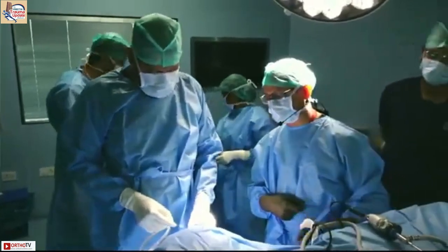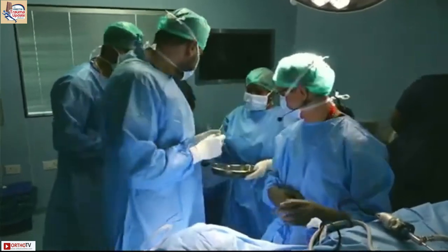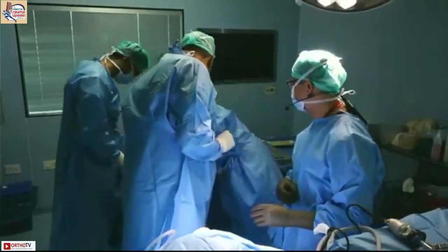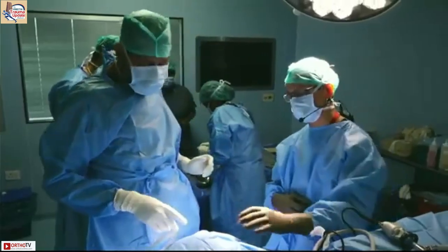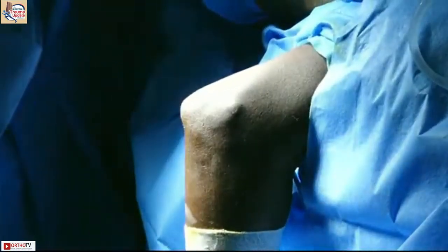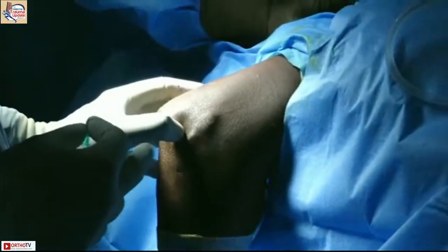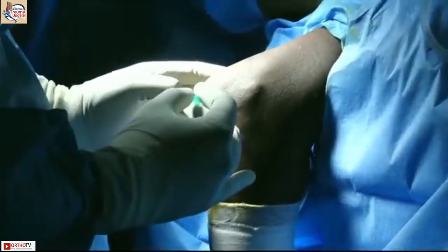Sir, can you show us the working and the viewing portal for the audience? Yeah, so what we're going to do is insufflate the joint. Simple needle. Green needle. So we've marked the soft spot. The soft spot is a triangle. It's a spot in a triangle between the lateral epicondyle, the olecranon, and the radial head. So mark the centers of those and you will get a soft spot.